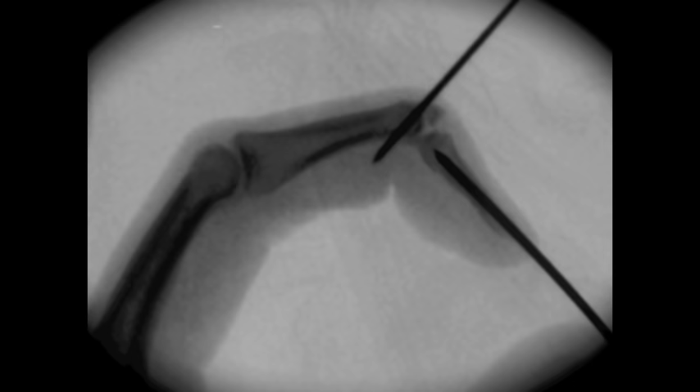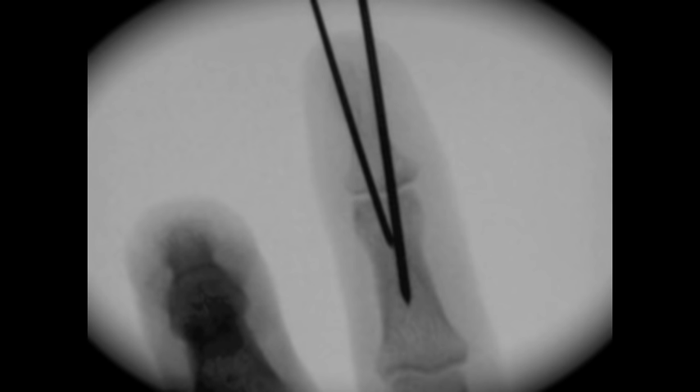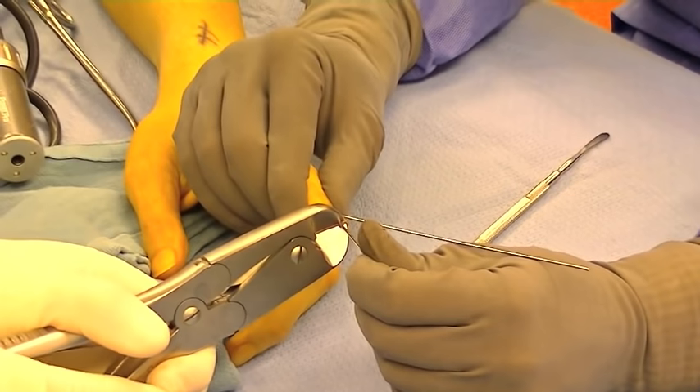The finger can be extended and the guide pin from the distal phalanx is driven into the middle phalanx. Once anatomic reduction has been restored, the pins can be cut flush with the skin.